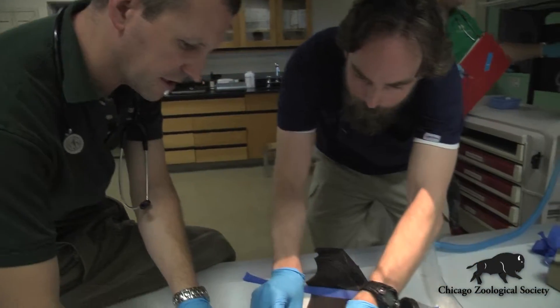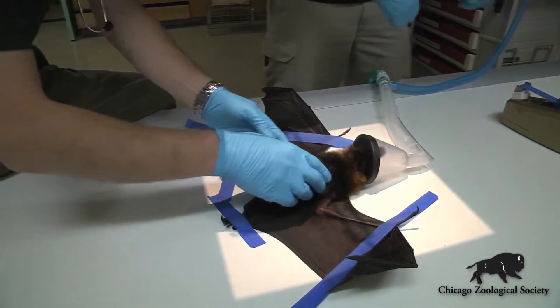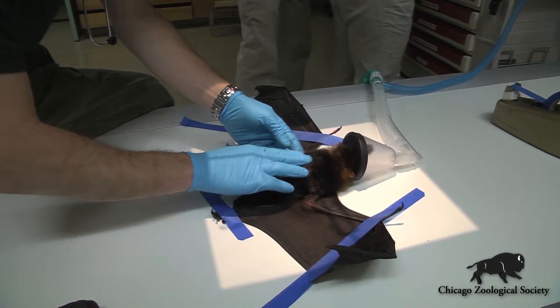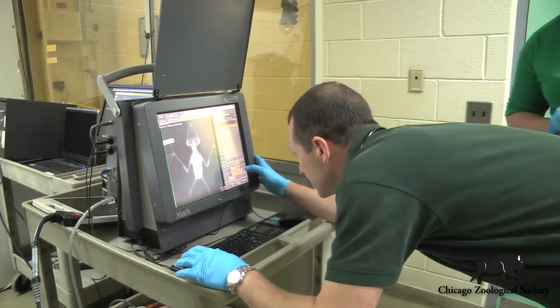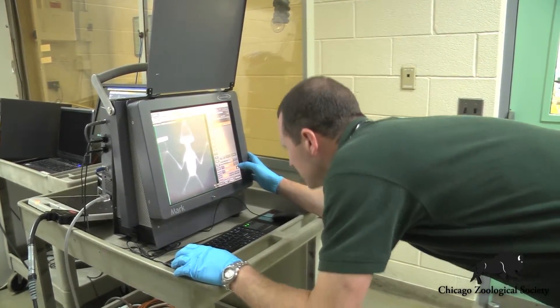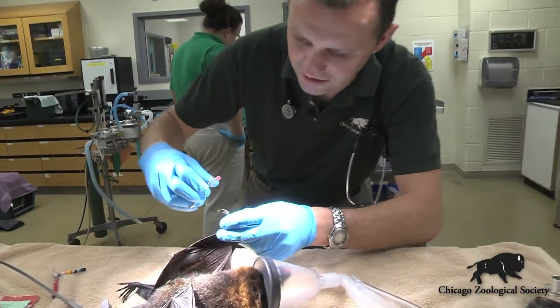We're using some very gentle adhesive tape here to hold the bat in position so we can get a nicely straight and evenly positioned x-ray to evaluate the internal organs and take a look at all of the bones and skeleton on this animal to make sure that there's no problems.